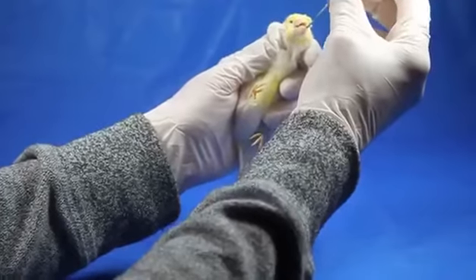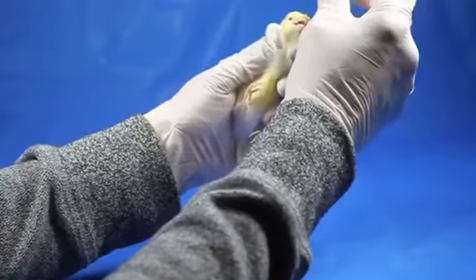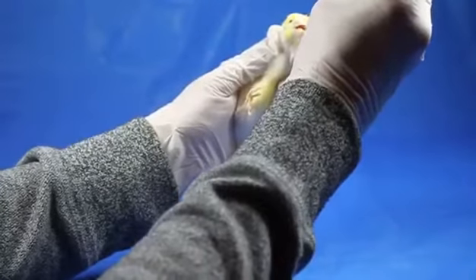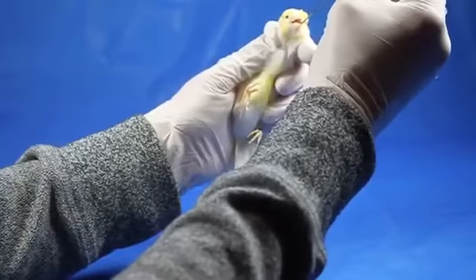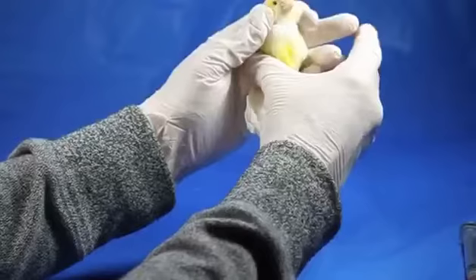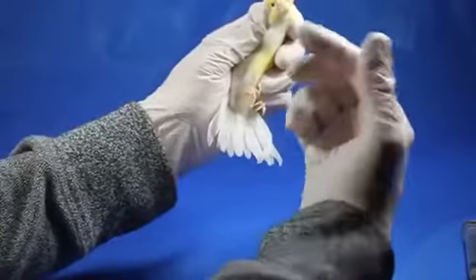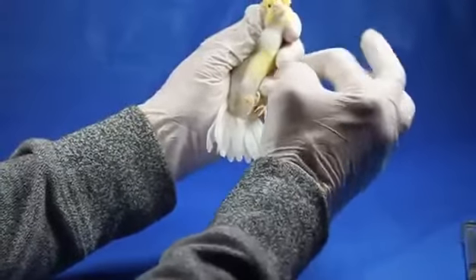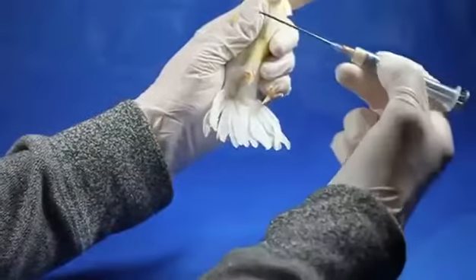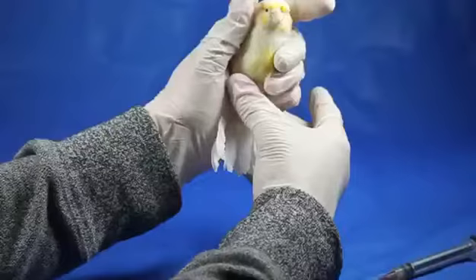Gravity pretty well takes it at that point — there is no resistance until the black mark is reached. I can feel the tube under my thumb here against his neck, and then I'm going to squeeze the plunger, pull out the tube slowly, and keep the bird upright. Very important: do not tilt the bird forward, otherwise it can regurgitate and inhale what you've just inserted into the crop. From here, disinfect the crop feeding tube and release your bird back into the cage.